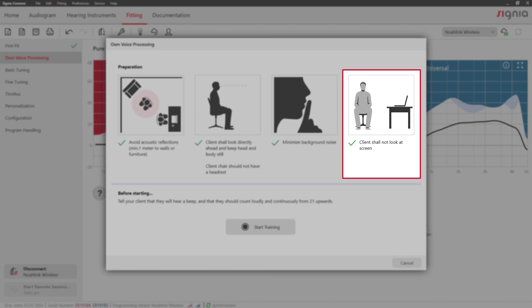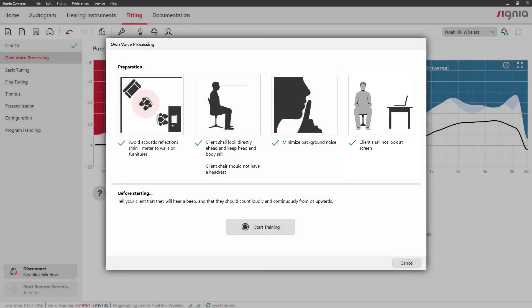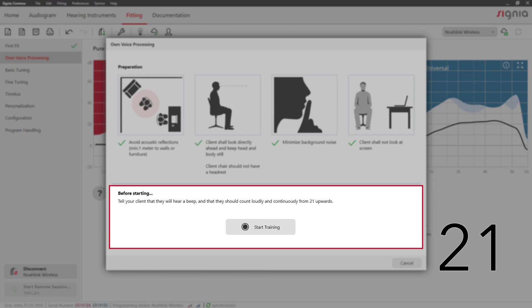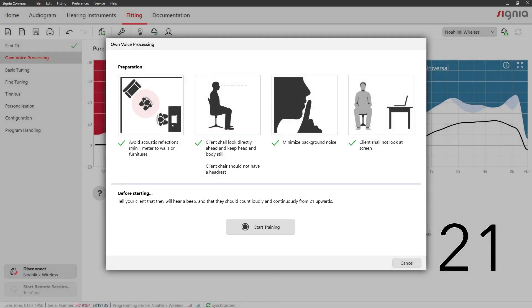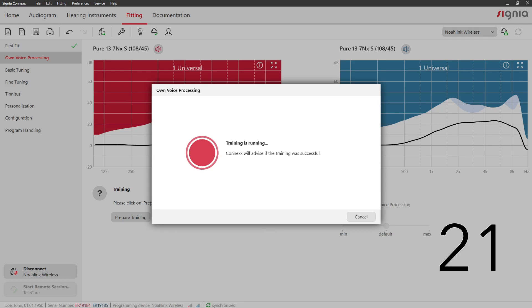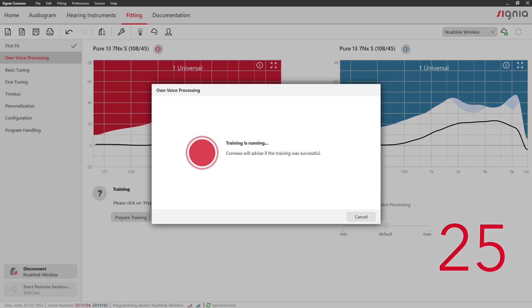Now instruct your client to count from 21 upwards once they hear a beep. The key is to talk continuously aloud during the test. Now you can start the training. Once the training is completed, a green check mark appears.